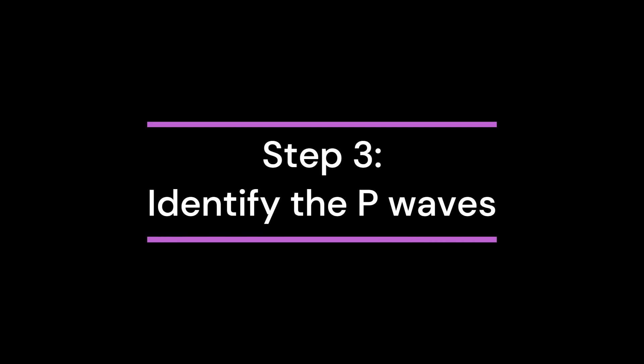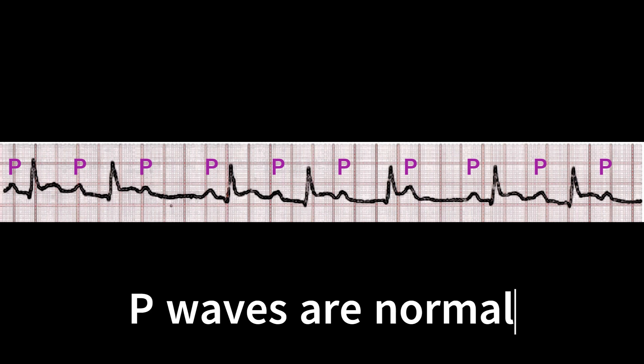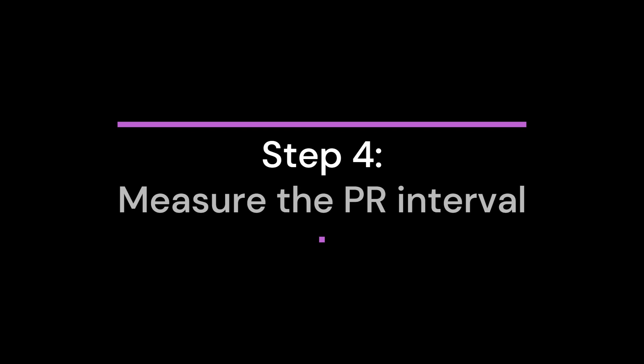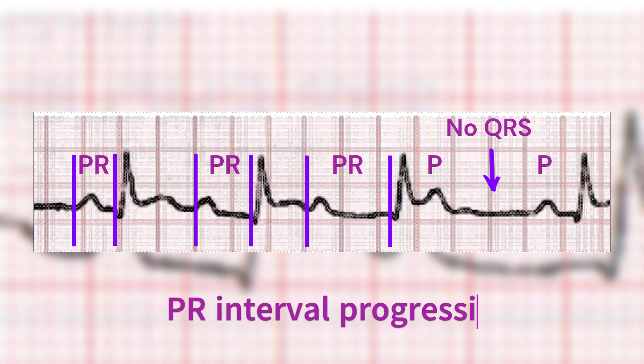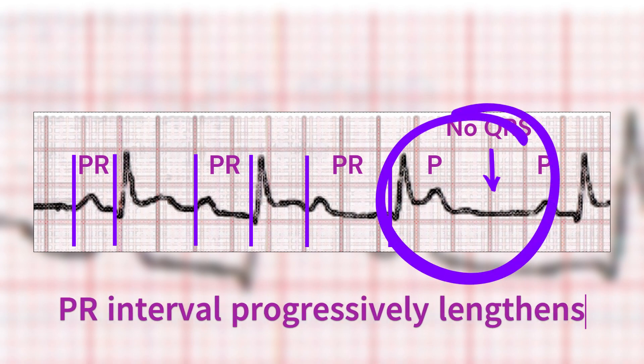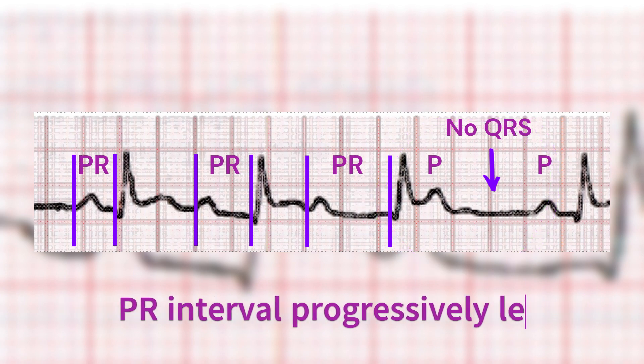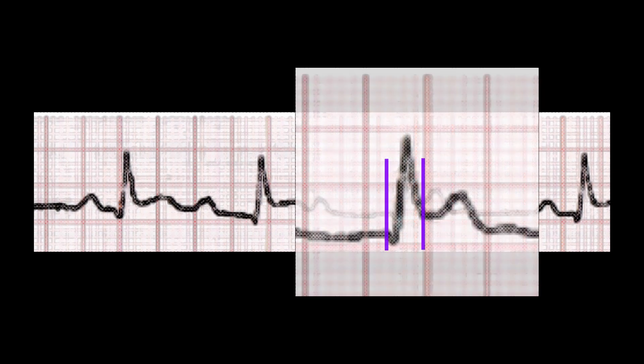Step 3: Identify and characterize the P waves. The P waves are all normal in morphology — upright and all have the same appearance. Step 4: Measure the PR interval. In Mobitz type 1 Wenckebach, the main hallmark is a PR interval that is progressively getting longer until a non-conducted heartbeat appears as a P wave not followed by a QRS complex. Step 5: Measure the QRS complex. The QRS complex duration is usually normal, measuring less than 0.12 seconds.